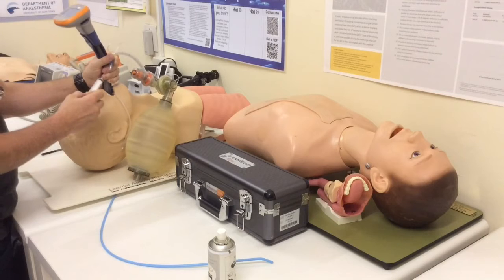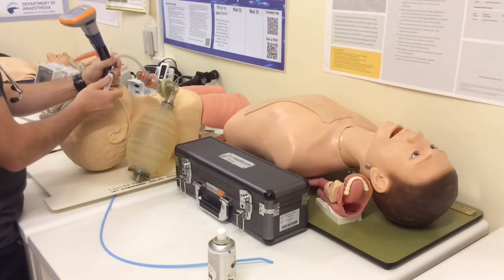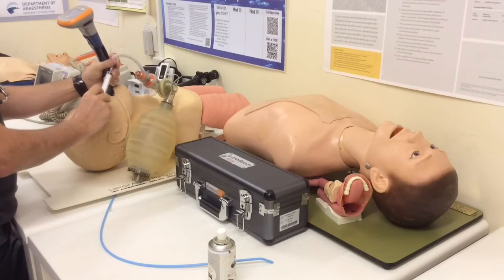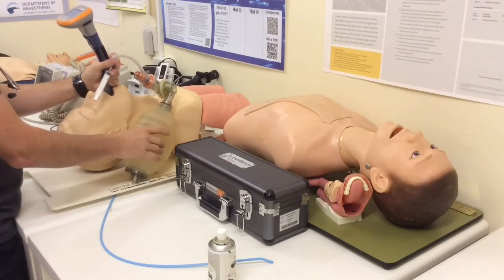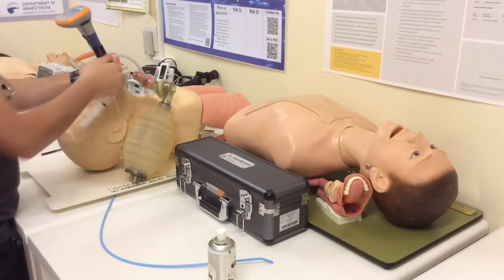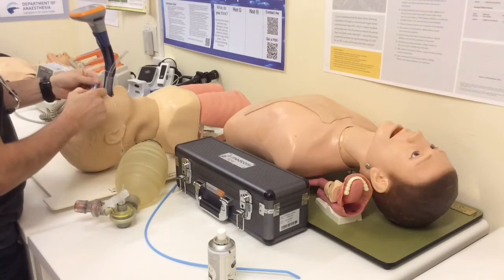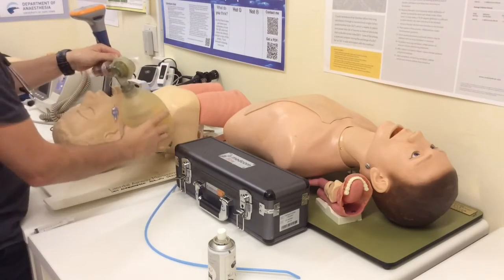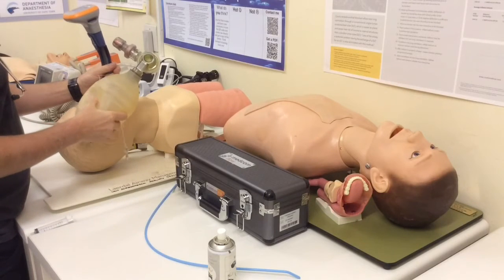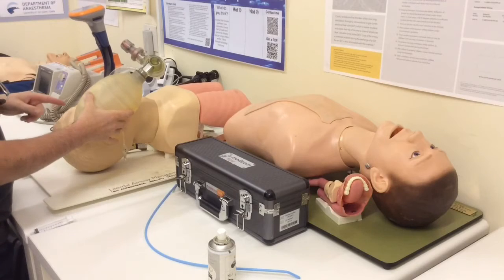Then, when I'm ready to intubate and my position is optimal, I can say to my assistant, could you please deflate the cuff, or I can alternatively do it myself. So, in between breaths on the ventilator, as soon as it's finished giving a breath, I deflate the cuff, I advance my tracheal tube, it goes in, re-inflate the cuff, and now I can carry on ventilating. I think I've picked a tube with a weak connector here. Alright, and now I'm ventilating with the endotracheal tube in place.